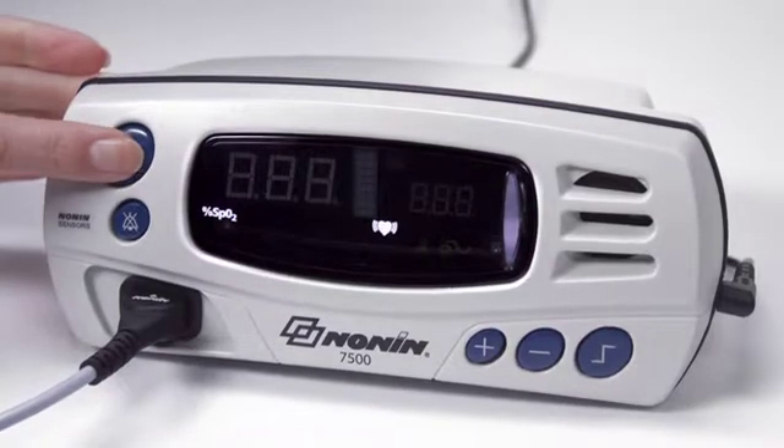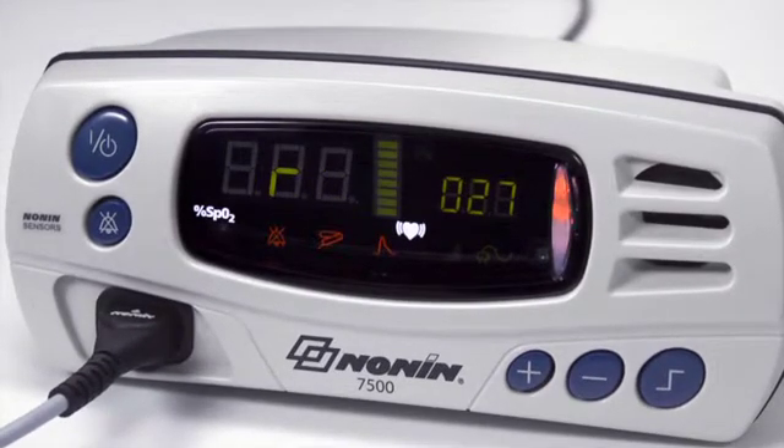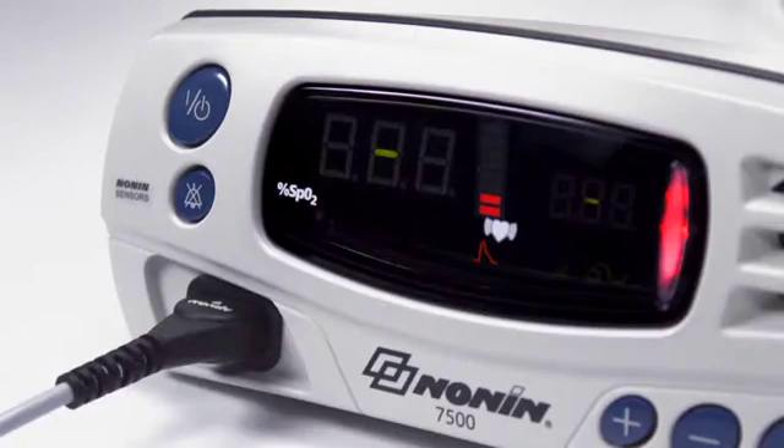Press the on-off button to start the unit. The oximeter will run through a power-up initialization as it turns on. Watch to ensure all the LED elements and information appears as shown here. If any LED elements do not appear or if any of the displays do not appear as expected, remove the unit from use and return for service or repair.